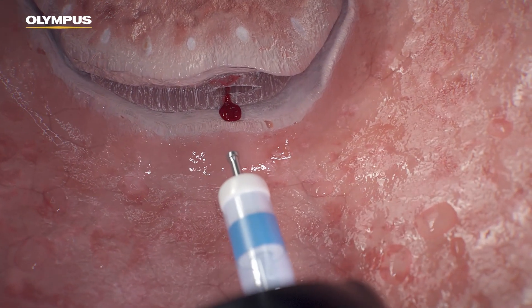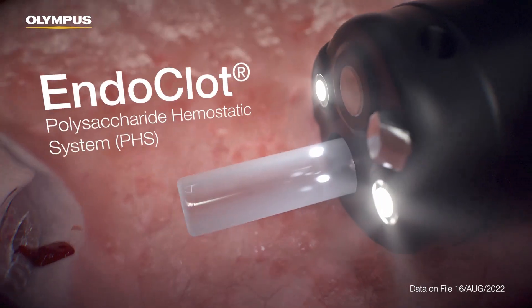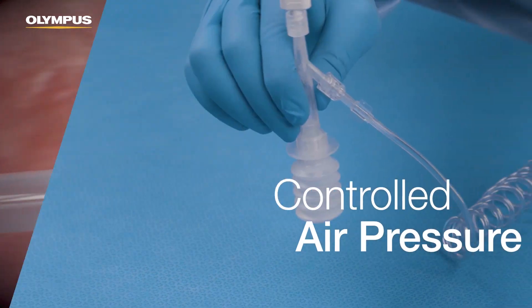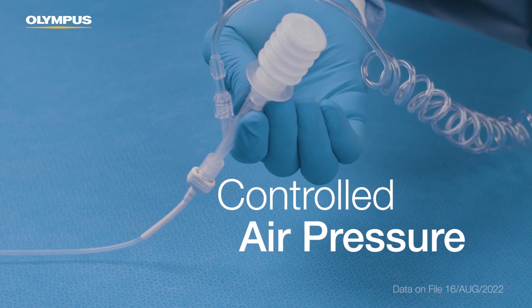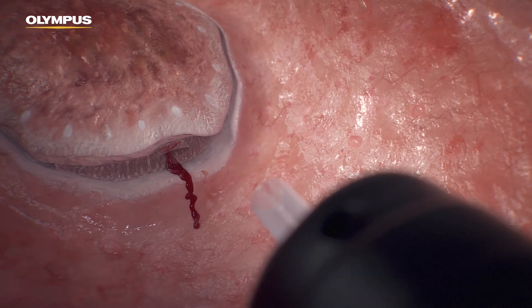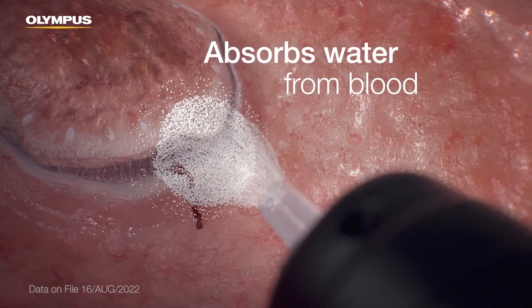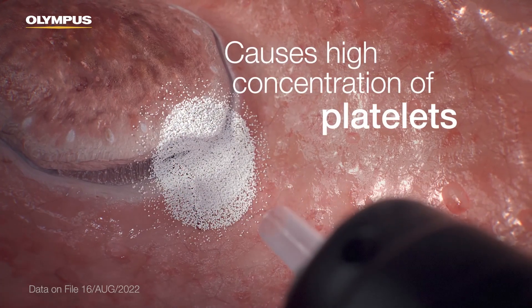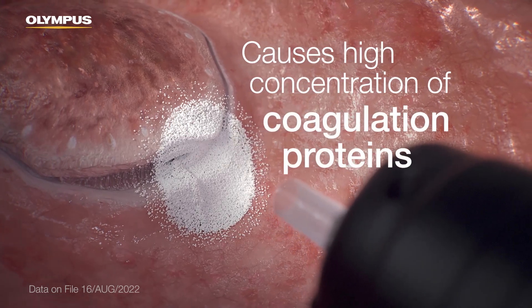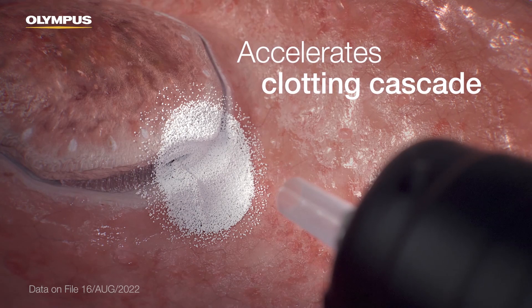Should bleeding occur, a hemostat is used. EndoClot PHS is an advanced powder hemostat applied during the procedure using controlled, consistent air pressure. EndoClot PHS absorbs water from blood while causing a high concentration of platelets, red blood cells, and coagulation proteins, thereby accelerating the clotting cascade.